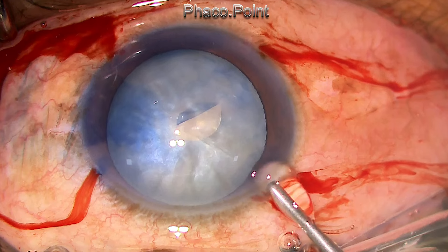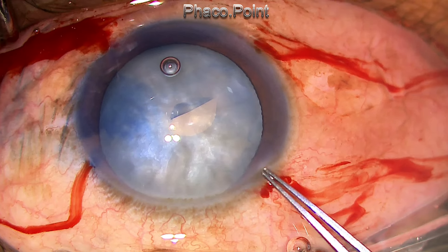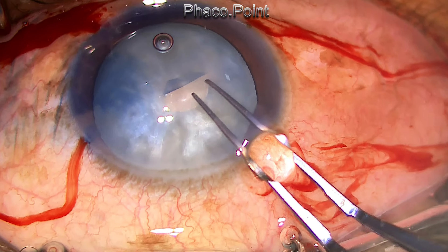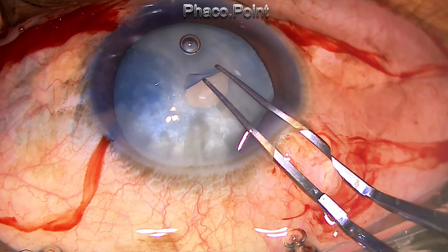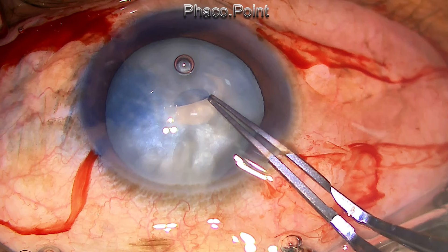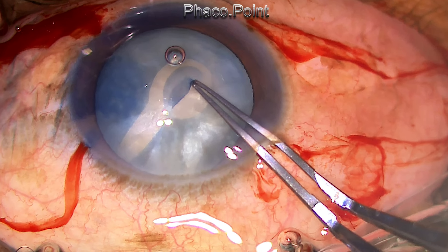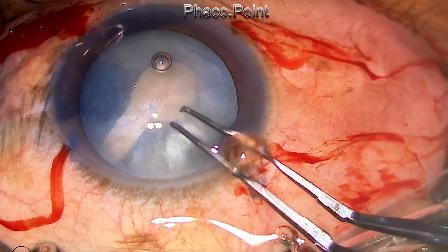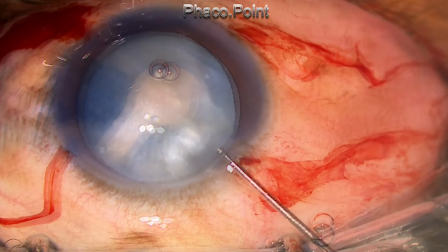This is the type of intumescent cataract that's extremely dangerous, because when I try to create the mini-rhexis, just see what happens. There was so much positive intralenticular pressure that even as I tried to complete the mini-rhexis, the edge of the rhexis ran off to the periphery. Having lost the rhexis, I now had to plot another course to carry the case.